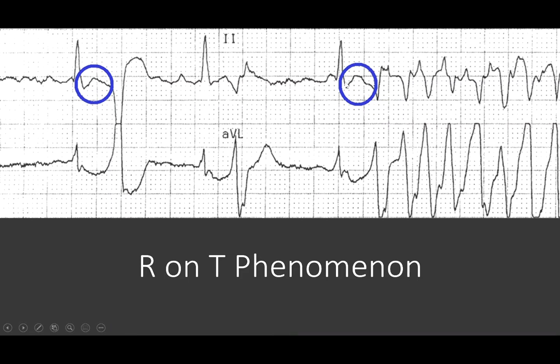So you can see here, we had that R on T phenomenon where this PVC fell right on that T wave, and we saw it kind of come in here because it was getting really close, and it put this patient into a rhythm that's not conducive with life.